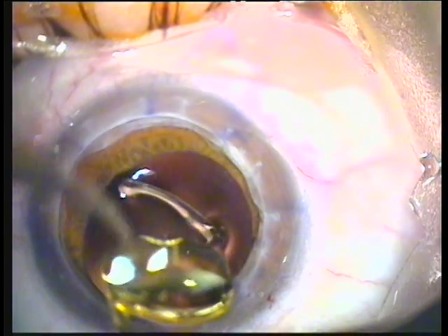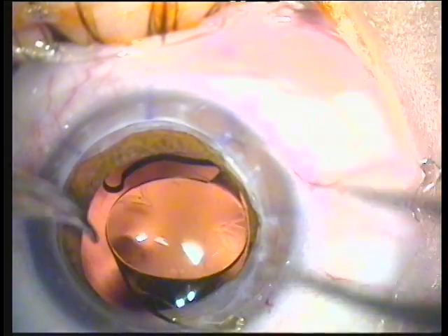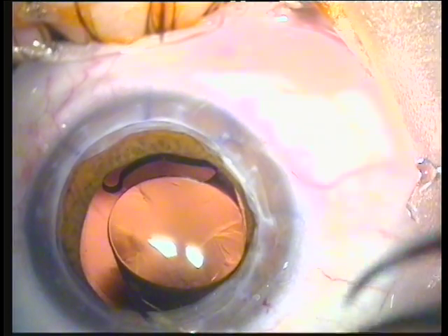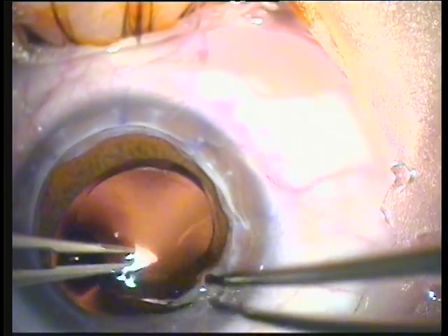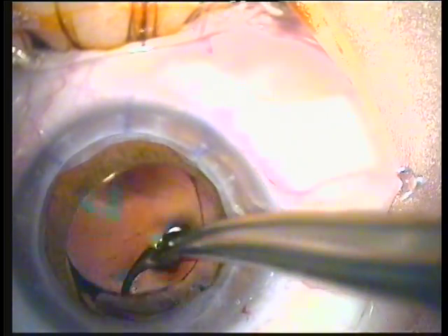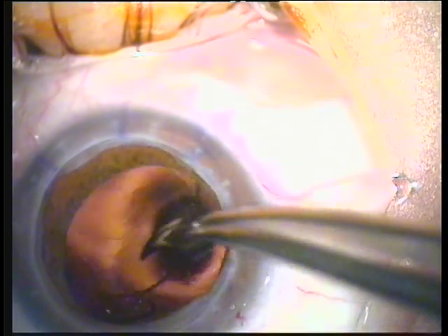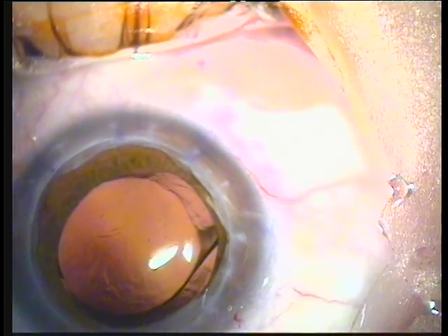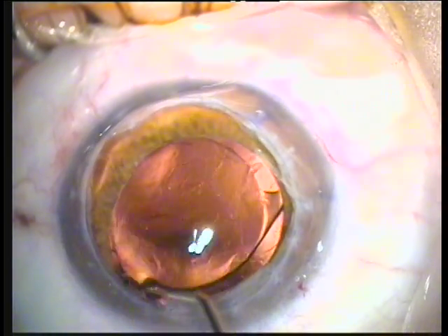I like the fact that this lens has the yellow tinge, something that blocks some of the blue light that may be damaging in these older patients, as their macula does not have the resistance that a younger patient may have. The trailing haptic is carefully placed within the capsule bag, and we have a perfect implantation within the capsule bag of both the inferior and now the anterior haptic. Special care is taken for that haptic to engage within the capsule bag as well.